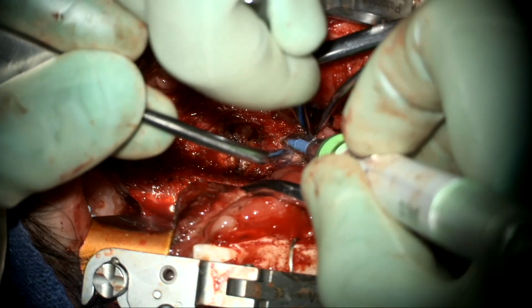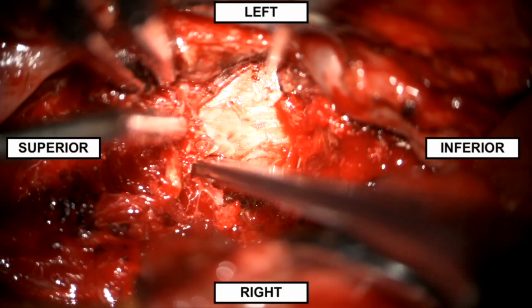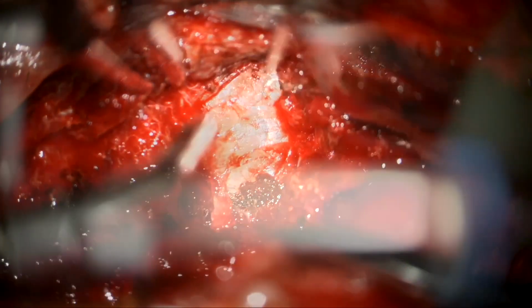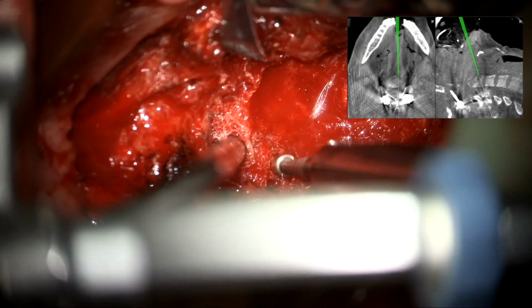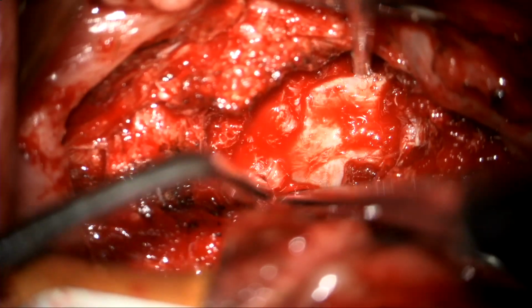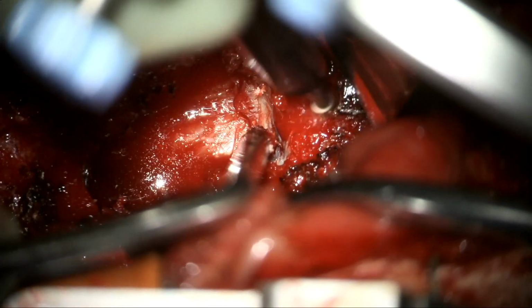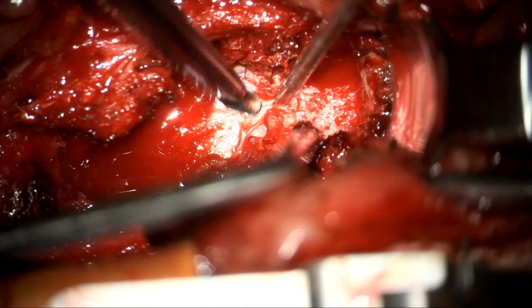Then we proceeded with the anterior corpectomies of C3, C4, and part of C2. The corpectomies were completed using a high-speed burr, rongeurs, and Kerrison instruments. Of note, the posterior longitudinal ligament was already found to be eroded. However, there was no dural violation during the procedure, and there was no evidence of epidural abscess.